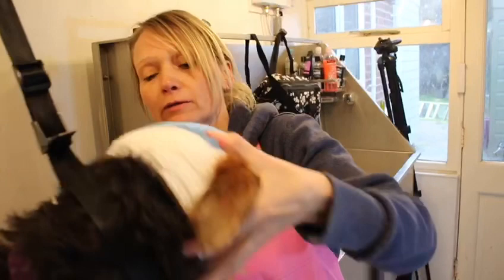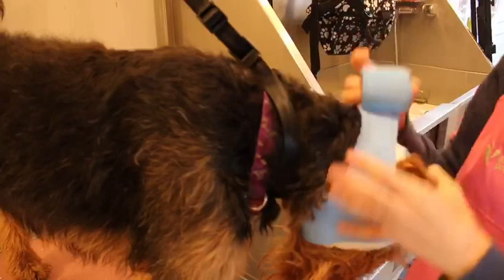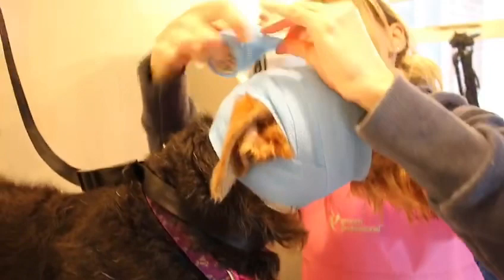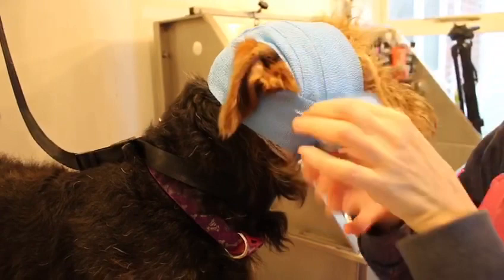The last layer is our protective layer. We don't want to put this layer on too tight — when you unroll CoFlex, give it a little bit of an unroll off the actual roll itself to free up the tension. We don't want it too tight because it forms quite a tight bandage around the head otherwise. This layer is just meant to protect the other two layers, so it's not supposed to go on tight.